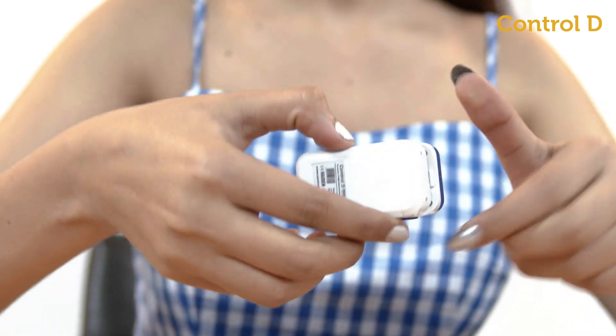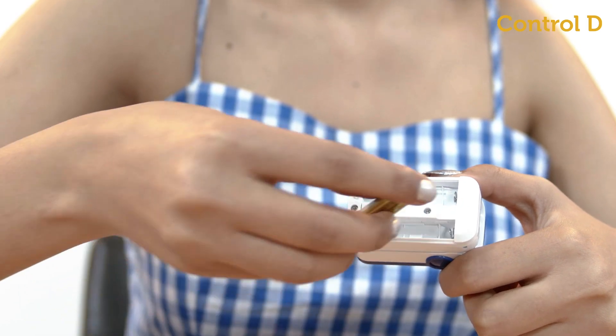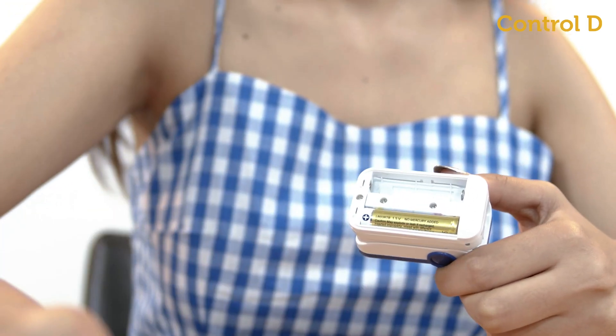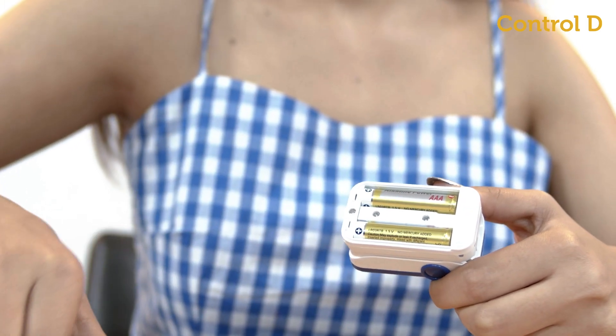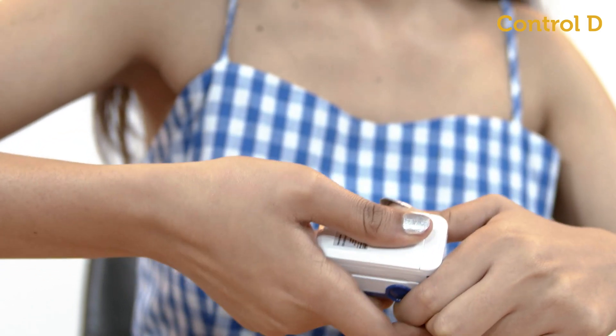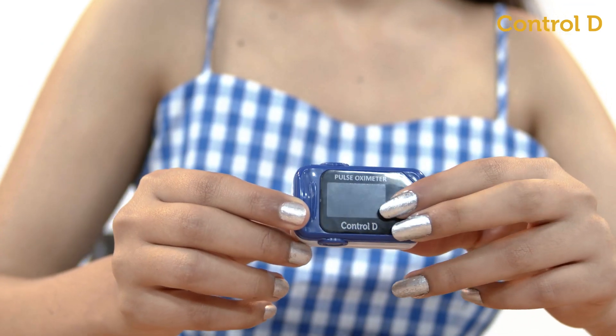Slide off the battery door and insert two fresh AAA batteries, matching the plus-minus markings in the battery compartment. Put back the battery door and you're ready to use the pulse oximeter. Switch on to see if the display is working.